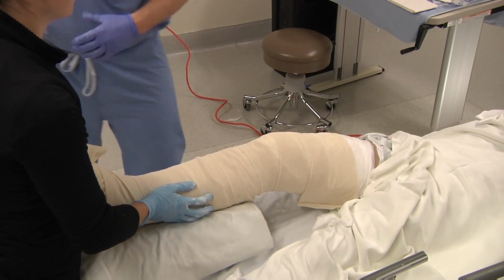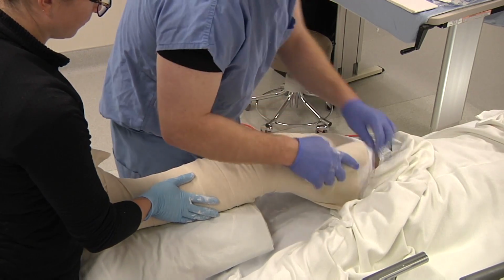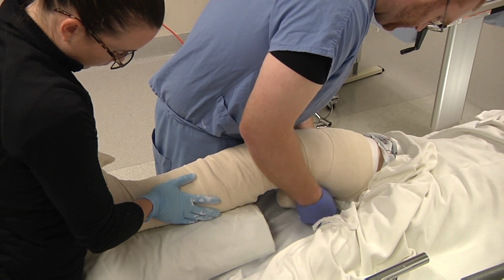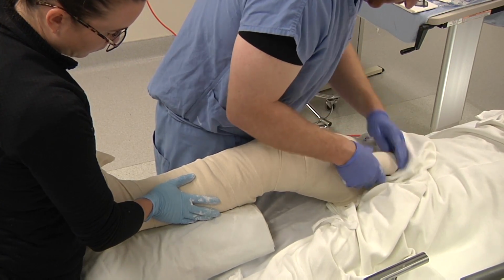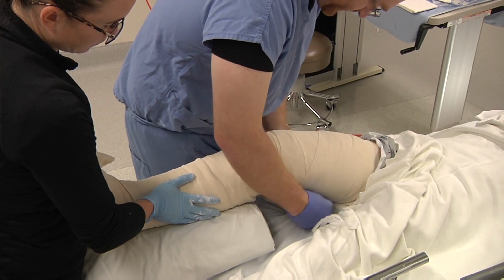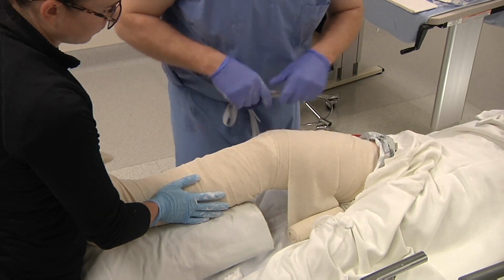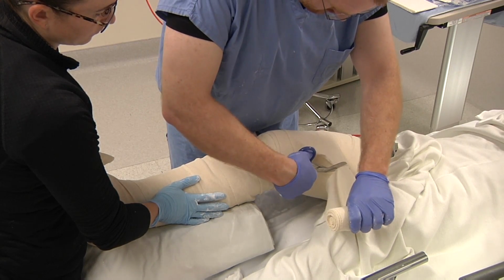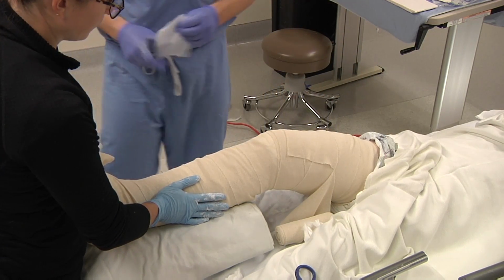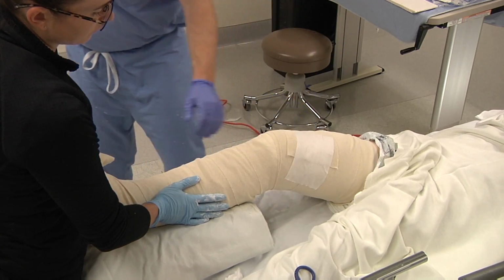Sometimes the bias doesn't go all the way. Grab another one. Be prepared for that. We generally don't use plaster with a catalyst, so we have a little bit more time. At this point, you can either focus on your reduction. Another trick is you can cut the bias 99.9% of the way. It's holding a little bit of tension there so that it doesn't unravel. Tear that off, and away you go from here.